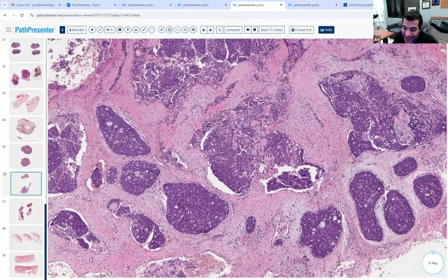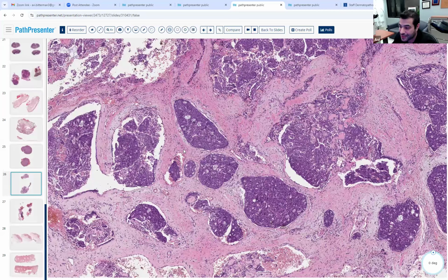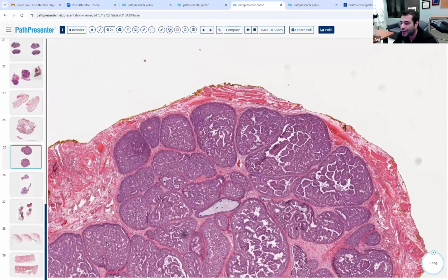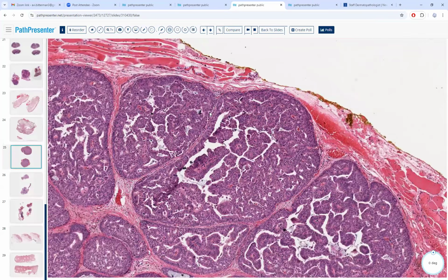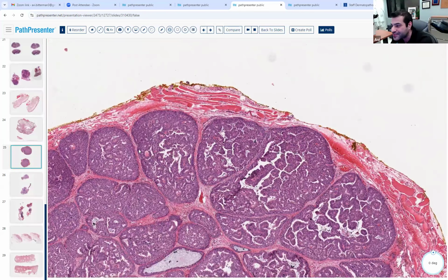So it can be tough. It can be tricky. I don't think you'll get one as tough as this one, because this one really does look like a basal. If they ask you EMP-SGC, I think they will more likely ask you this one. This is the prototypical one that they like to test, right? This kind of inverted pattern of mucin with pseudo rosettes or cribriform architecture. And they may even tell you it's from the eyelid.